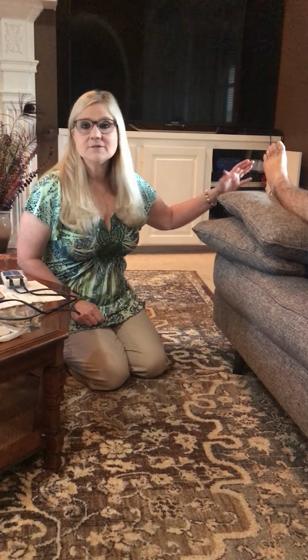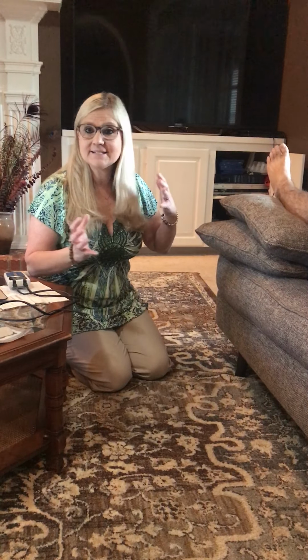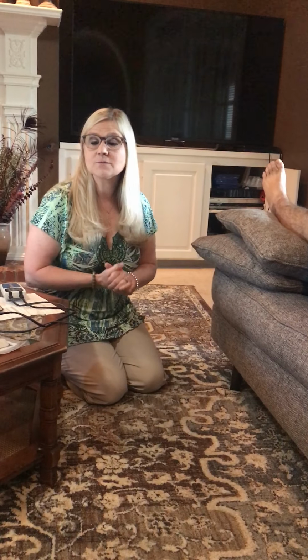So what we're going to do is IFC to try to decrease his pain, decrease some of that edema, and get him more functional. We're going to choose a protocol to sweep it from high rate to low rate because we want to get both endorphins, close the gate, some enkephalin release immediately to get some good therapy going on.